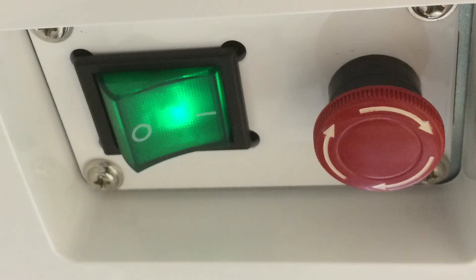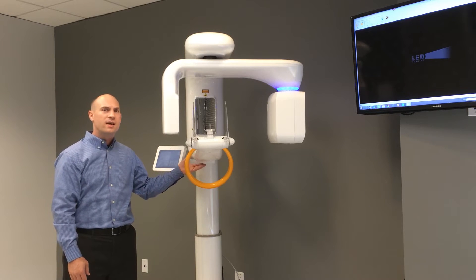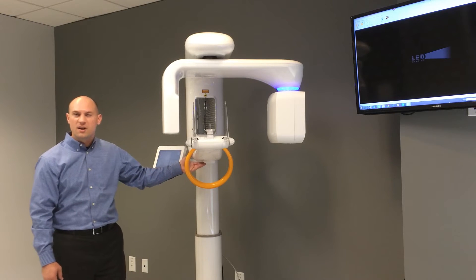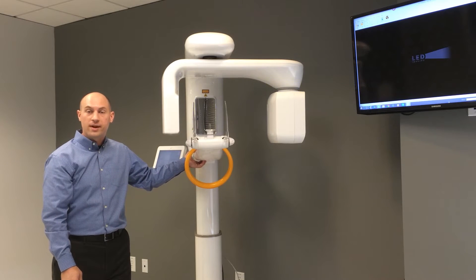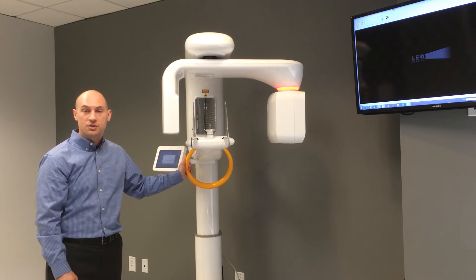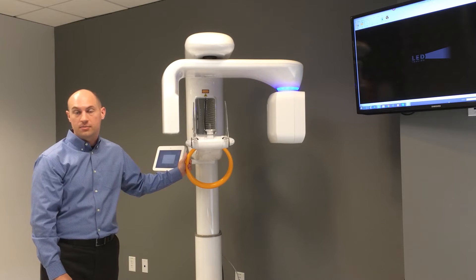Underneath the chin rest we have our power switch, which will turn the machine off and on — a lit green switch — and beside that is a red emergency stop button. If someone accidentally bumps the emergency stop, the blue light on top of the X-ray generator will go to a red condition. To exit this mode, simply make a counterclockwise turn of the emergency stop switch and the machine will return to normal.